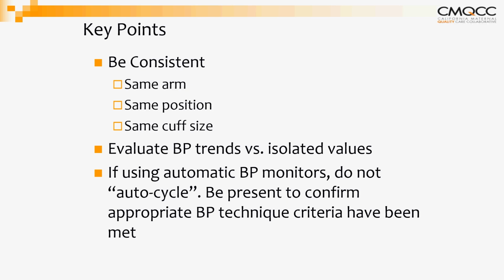And just to follow the same theme, it's really important to be consistent: same arm, same position, and same cuff size. Just as we mentioned earlier on, it's important that if the wrong cuff size has been used and it's been recognized and it's been changed out, that it is consistently used to ensure that the blood pressure is taken correctly.